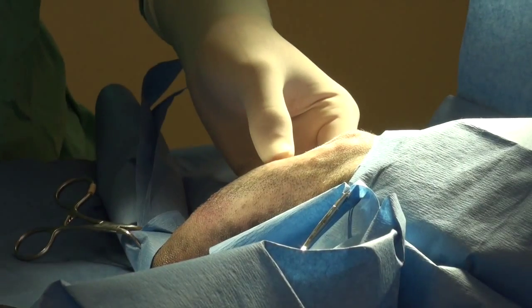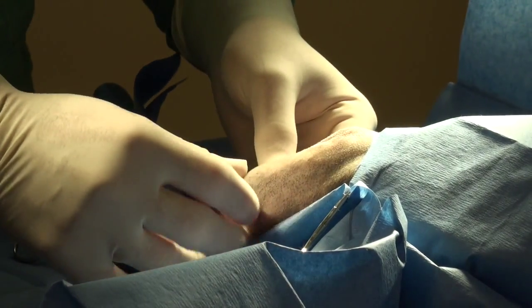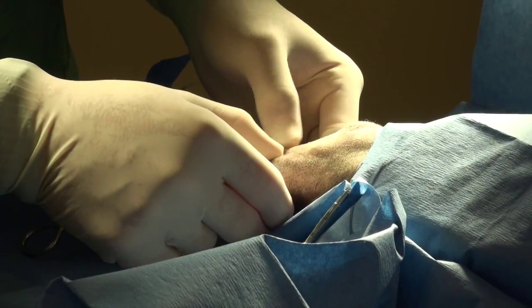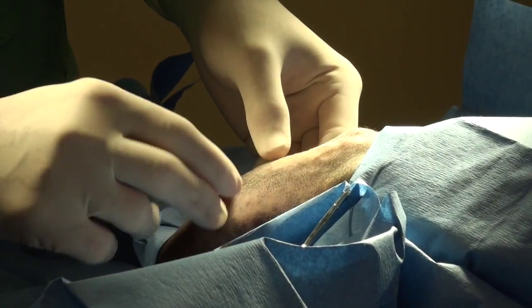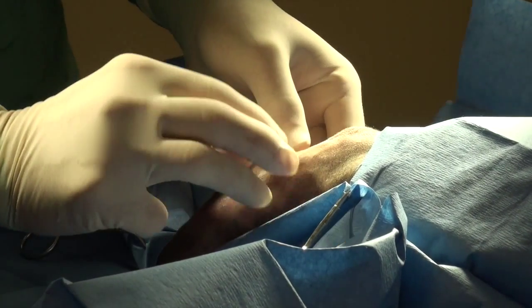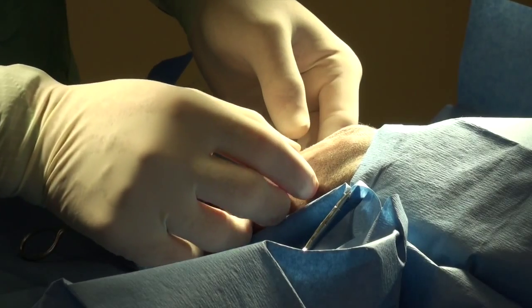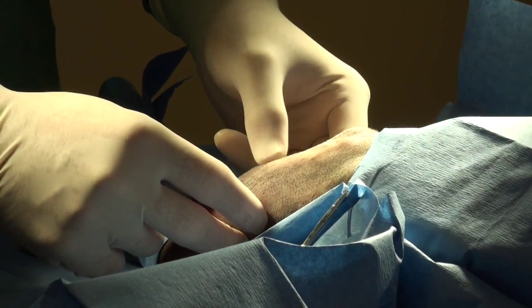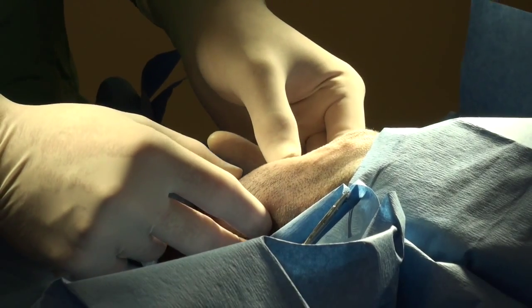We're ready to incise the skin. I've chosen a cranial lateral approach so that we have a good muscle mass covering the plate. The only concern is for the patient to try to actually remove it.